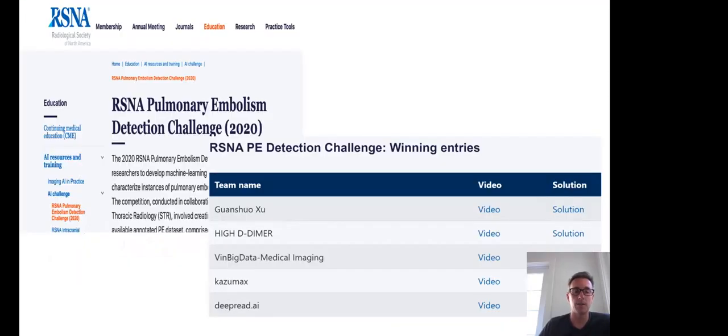And so you can actually go and access highly curated, annotated pulmonary embolism CT data, annotated by expert imagers, subspecialist radiologists, and that was part of the 2020 RSNA Pulmonary Embolism Challenge. And this data is from several countries and 4 institutions and comprises more than 12,000 different CT studies. So it's the largest data set of its kind, and had more than 80 expert thoracic radiologists as annotators.